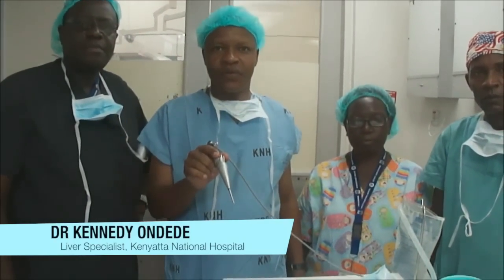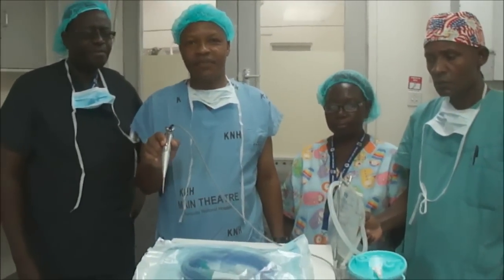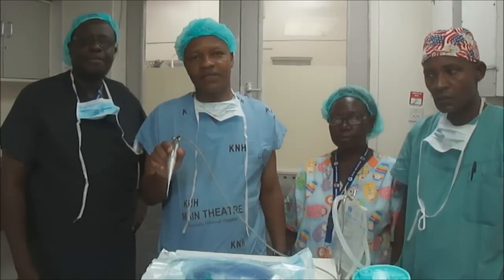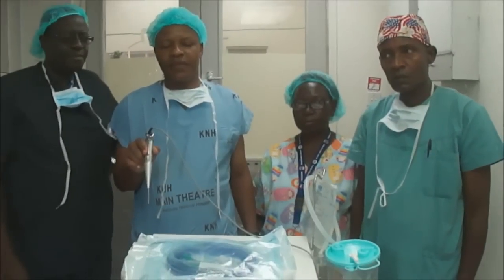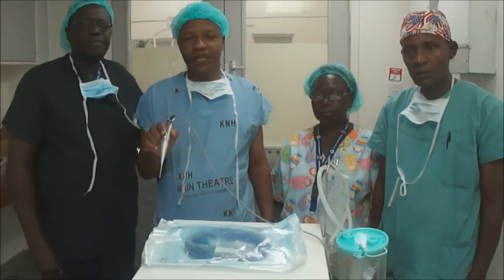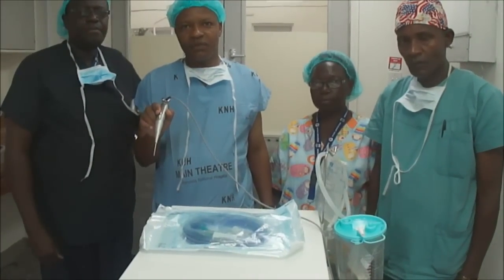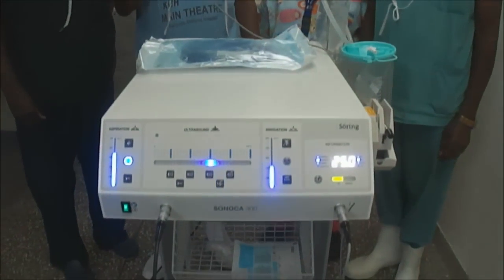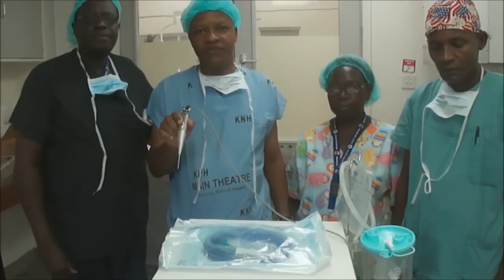It can suck at the same time. This machine is the first machine to be acquired in this country and in the wider Eastern and Central African region. We only have similar machines in Egypt and South Africa. The basic use for this machine is to split the liver — primarily to remove liver lesions or tumours. Areas where we have liver tumours can be cut off from the rest of the liver using this machine in a very safe manner.